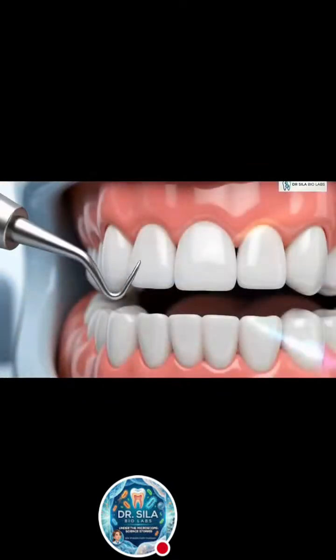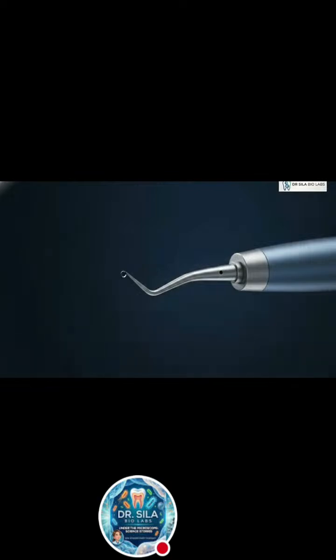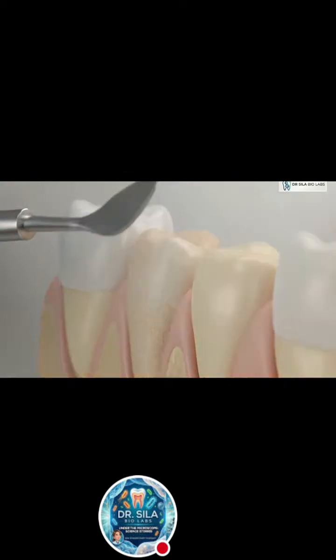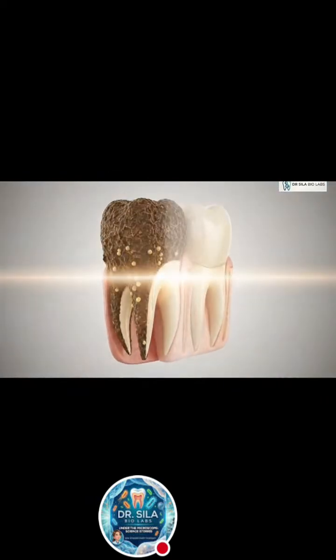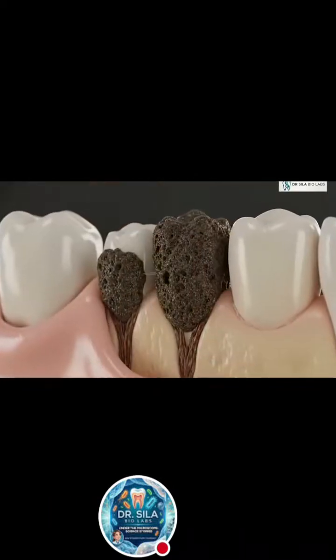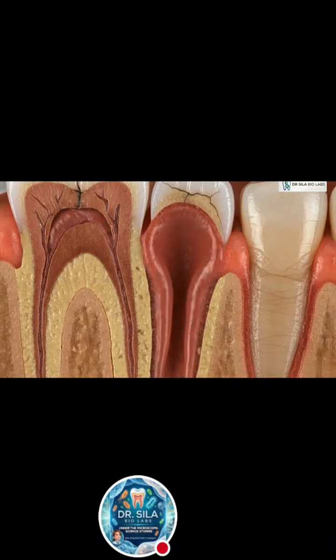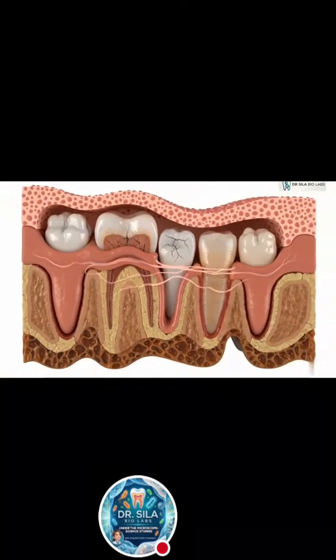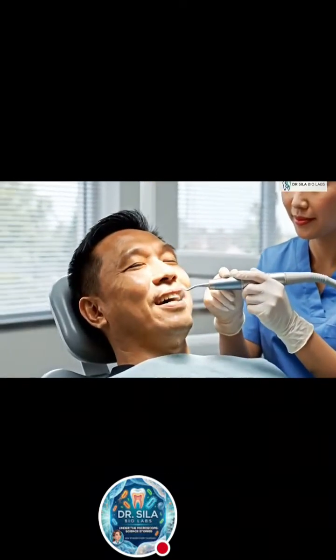Specialized ultrasonic tips are designed to reach deep beneath the gums. The vibrating tip carefully disrupts and loosens the hardened deposits. Hand curettes provide precise access to areas that require detailed cleaning. Once the deposits are removed, the source of chronic irritation is greatly reduced. The surrounding tissues can now begin to heal. The gums gradually tighten around the clean tooth. The ultimate goal is to create an environment that is easier for both the patient and the dentist to maintain. But what does scaling actually feel like from a patient's perspective?